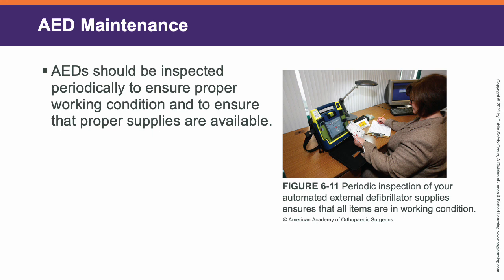Now, AEDs are inspected periodically to make sure that they're working. The battery should be checked to make sure that everything's working correctly. This is usually about yearly, sometimes more. Different manufacturers will have different recommendations on that.